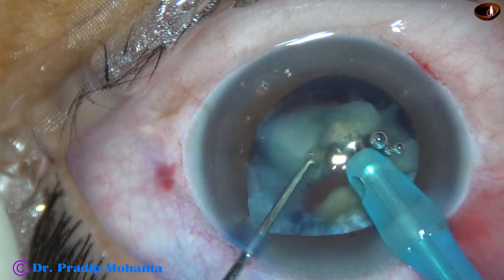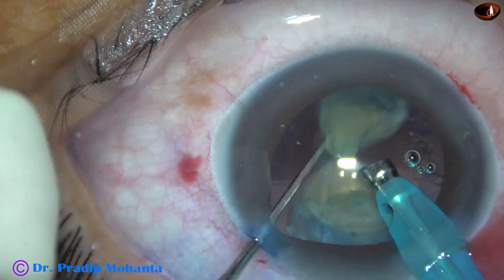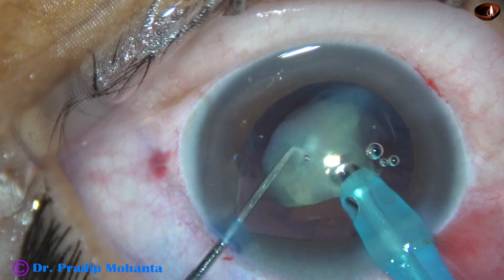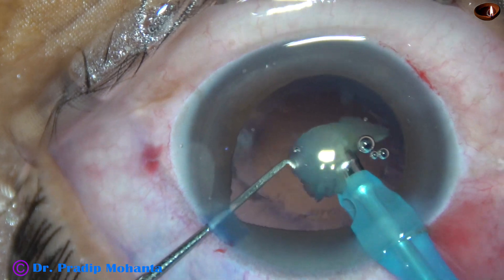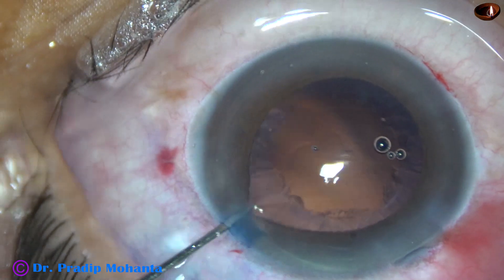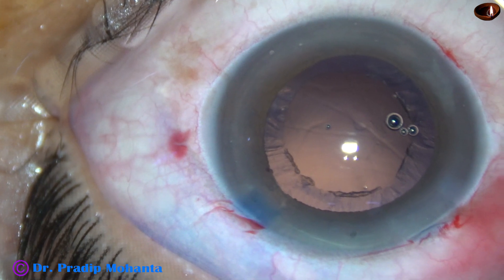Observe that the iris is tending to prolapse through the side port and has got incarcerated in the side port. Whenever this happens, we must remove the handpiece quickly, let the iris fall back, and then remove the chopper. Otherwise, we can cause injury to the iris.